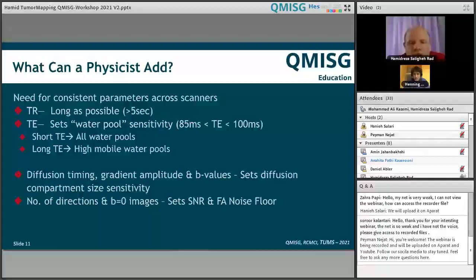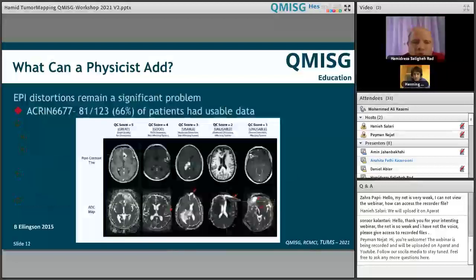We have diffusion MRI in every slice, so every slice is shimmed well, the quality of diffusion is improving greatly, and the hope of having better information from the diffusion modality is increasing every day.